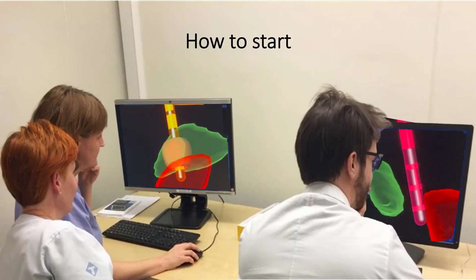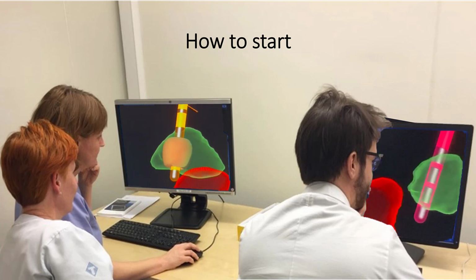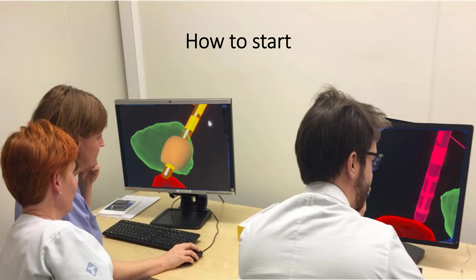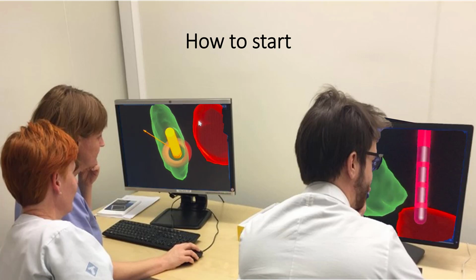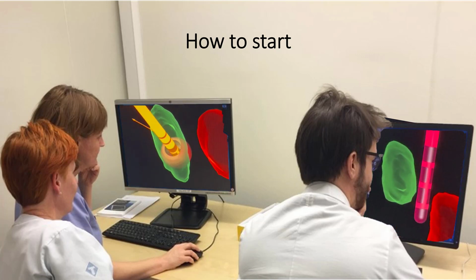If you are just starting with visual programming, then I suggest that you upload a few of your successful cases stimulated with what you consider to be typical stimulation parameters, just to get a feeling of how the field of stimulation can look regarding anatomical location and size in such patients.